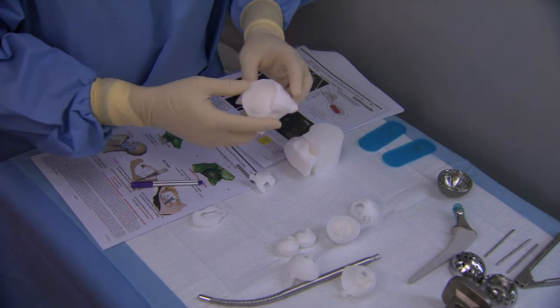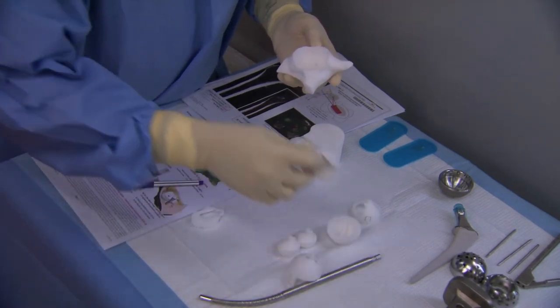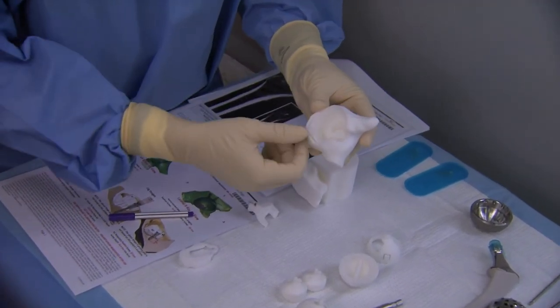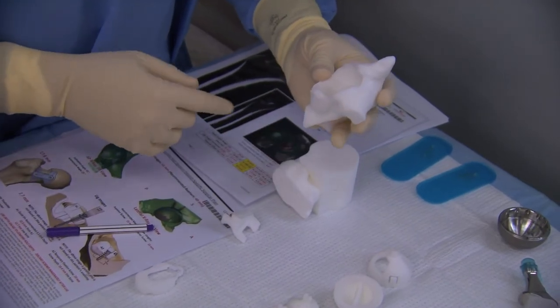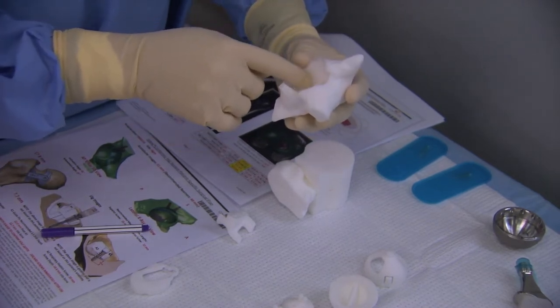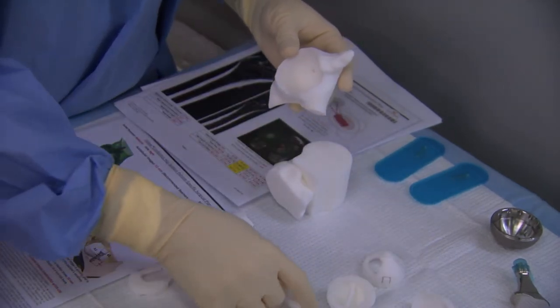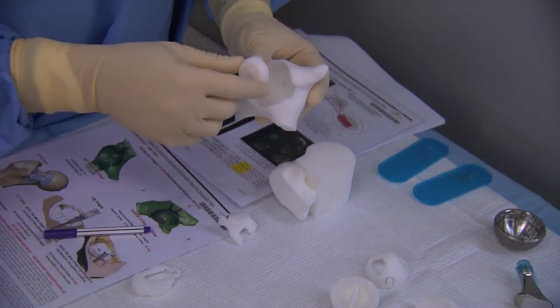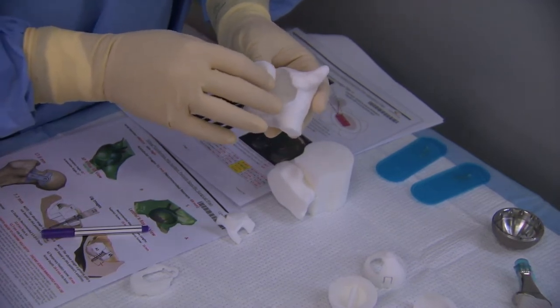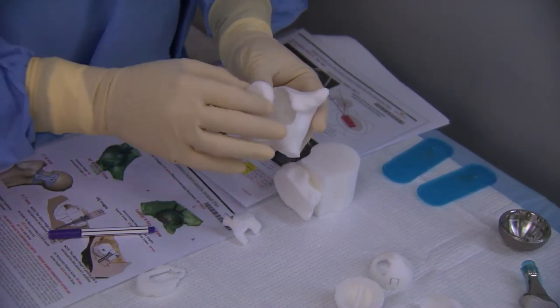On the acetabular side, you're given a jig model of the patient's native acetabulum. The A1 jig fits into the acetabulum, references the inner surface as well as an exterior rim point. Once that jig is placed and secure, we're going to be drilling two center lug holes and then a third piloting hole. Into those holes, we're going to be placing the A2 jig. This jig will place into the acetabulum and will help control both the positioning of your reamer — so you don't ream eccentrically — as well as the depth of your ream.